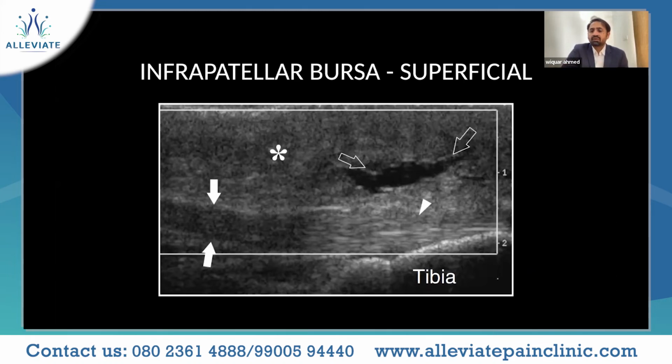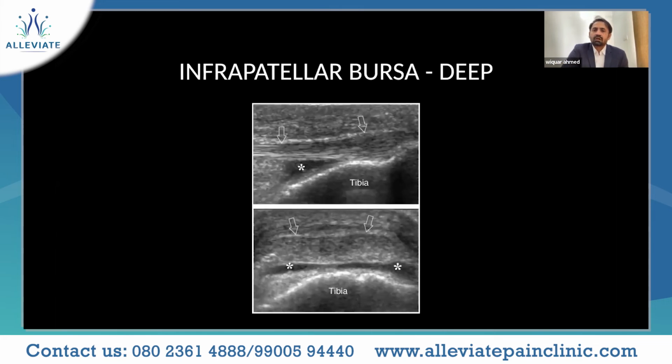These bursas can be very painful. And this is an infrapatellar bursa, right beside your Hoffa's fat pad. In the same view in which you are visualizing your patellar tendon, that is the infrapatellar area, you can see the Hoffa's fat pad, and when you give a little bit of flexion and tilt the probe, you can also visualize your ACL, the distal aspect. So there you can again do your needle interventions.